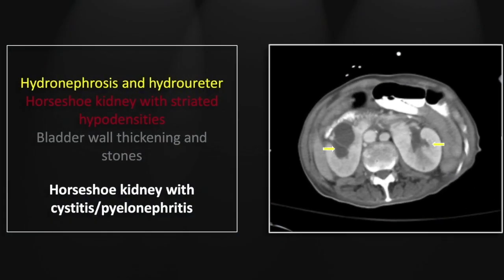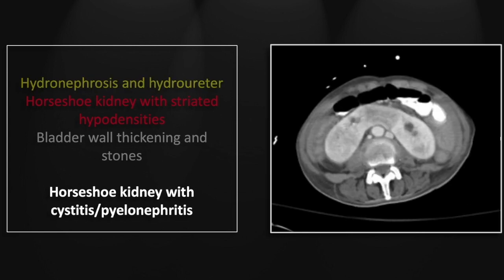We start with fairly obvious hydronephrosis and a wedge-shaped striated hypodensity in the left renal parenchyma consistent with focal pyelonephritis. On this lower image there is a very thick parenchymal isthmus to this horseshoe kidney, which is also demonstrating those reduced perfusion changes consistent with focal pyelonephritis.